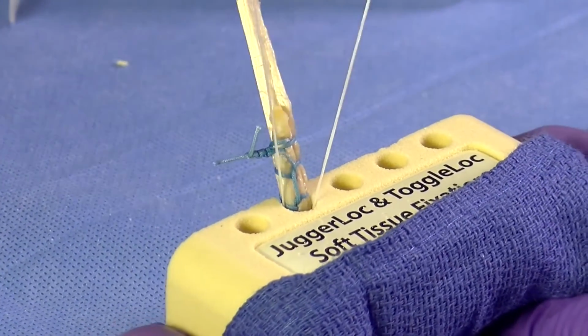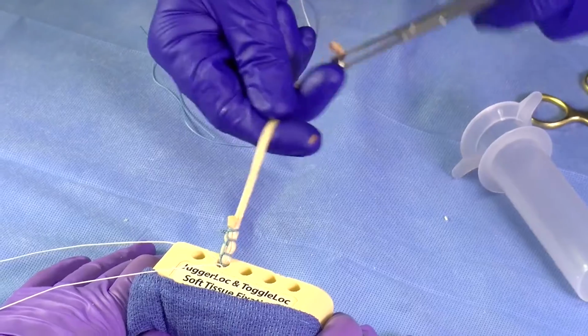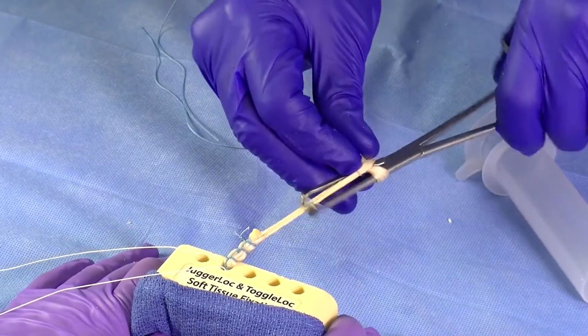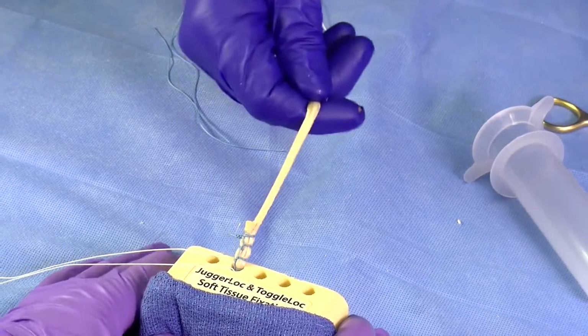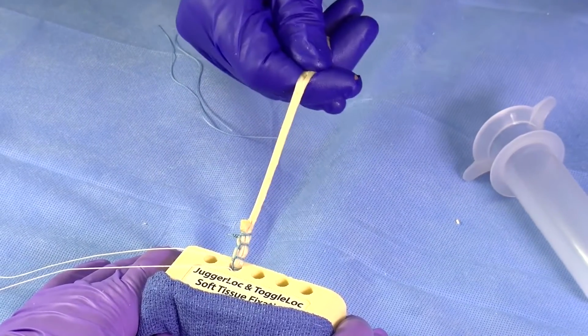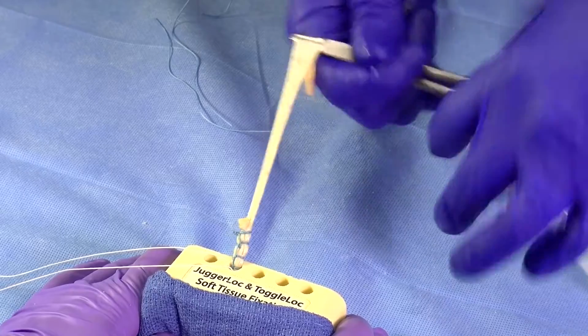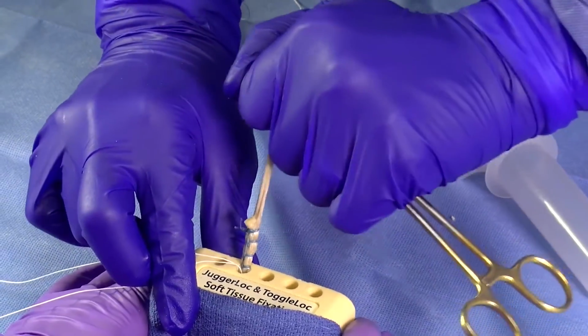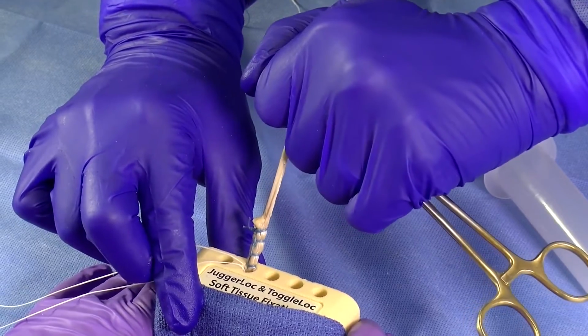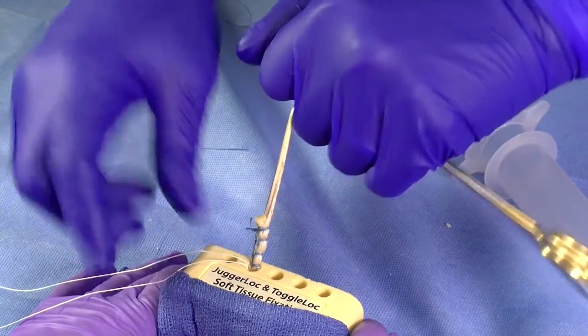So once again, that's fully seated. For demonstration purposes, I'm going to really try to pull on this. But you can see the tendon is very much seated in the socket for a very small tendon with this doubled over technique, as well as the interference fit in the socket. I mean, this is very secure.